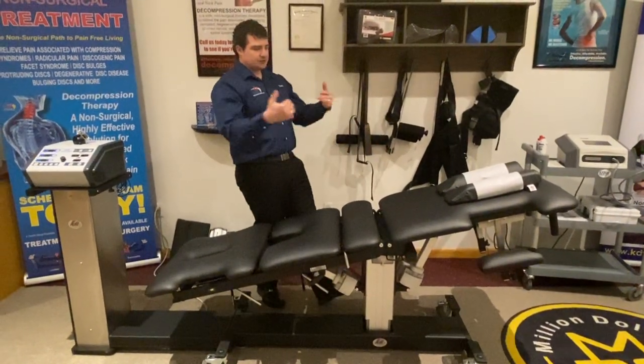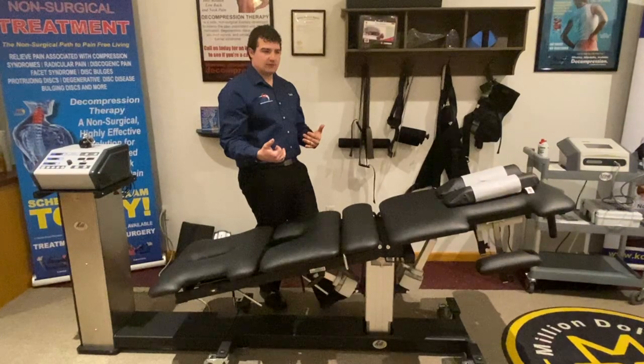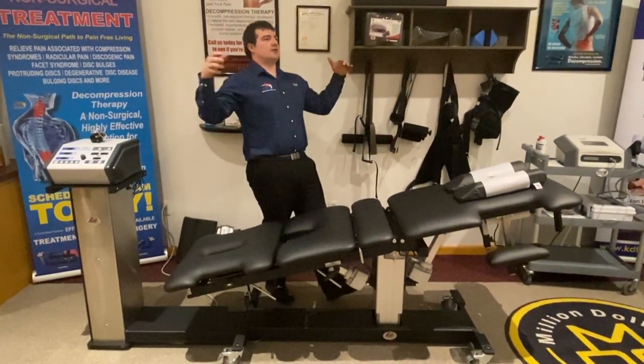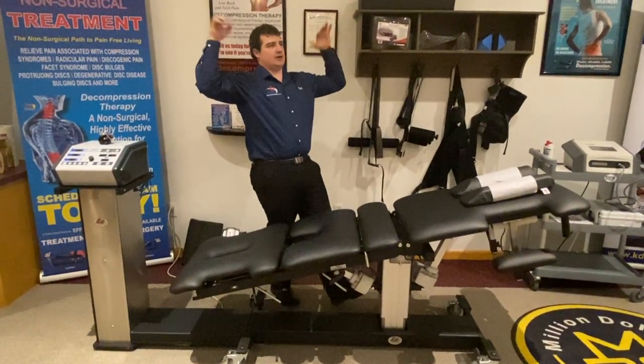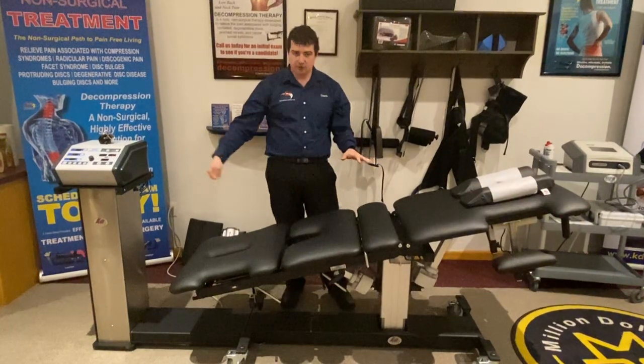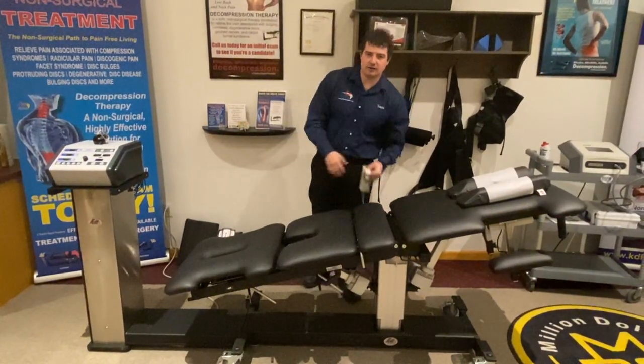You can also do supine inversion therapy for sports performance enhancement. If you have thoracic herniations, you can go on your back with arms above your head and let the patient's own body weight distract the spine. You can loosen the spring to make that feeling enhanced.